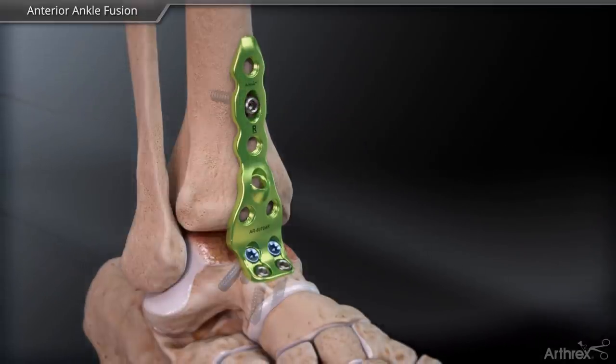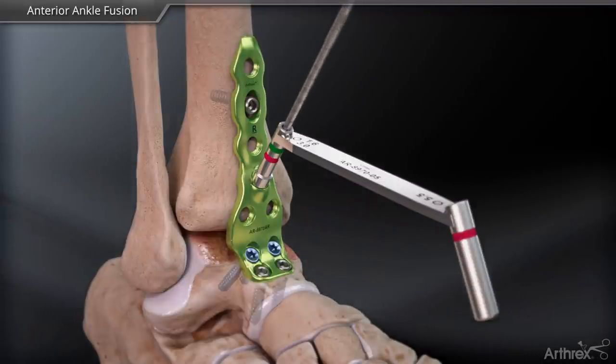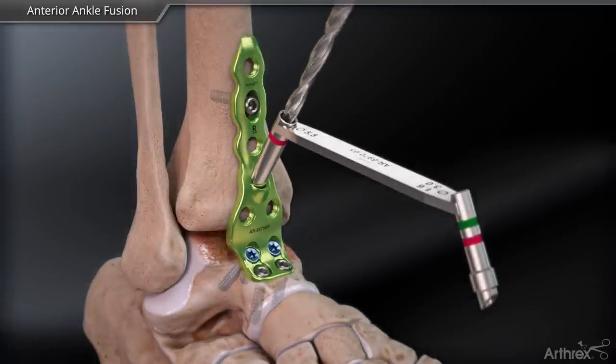In the anatomic lag screw hole, use the compression drill sleeve and 3.0 mm drill bit to drill the tibia and talus. Then rotate the drill sleeve and over-drill the tibia with a 5.5 mm drill.